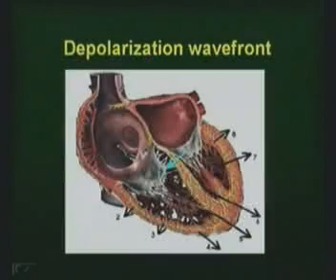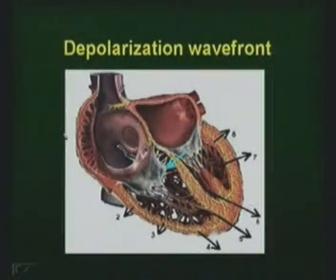Intervals, I could have gone into it, but we'll have to skip a lot of things if we do. The normal P is 0.12 seconds, and the PR interval is 120 milliseconds to 200 milliseconds. I think these things are very well known to most people and they are available; it doesn't require understanding, it requires memorizing. So it's not going to be a big thing trying to talk about that. My idea was to make you understand so that you can apply it rather than mug it up.